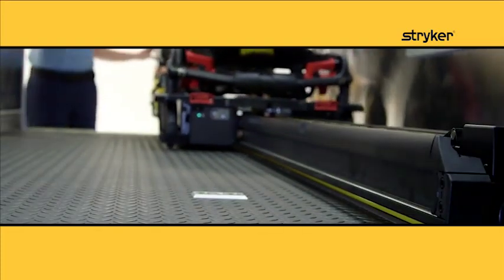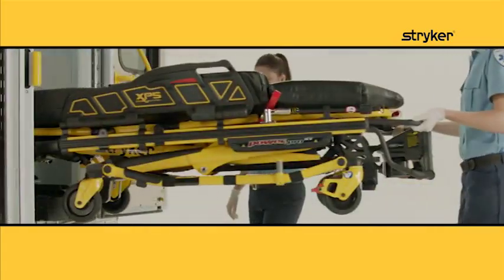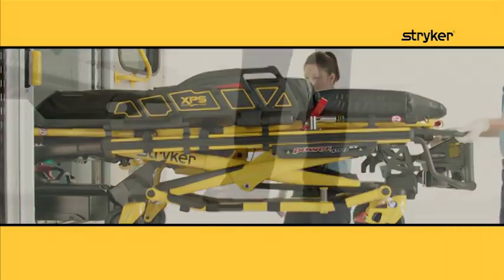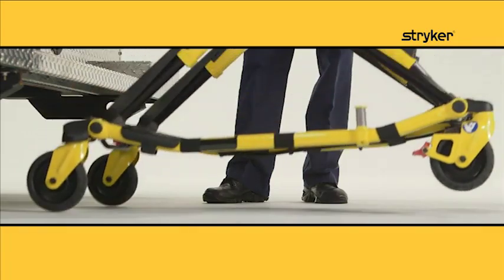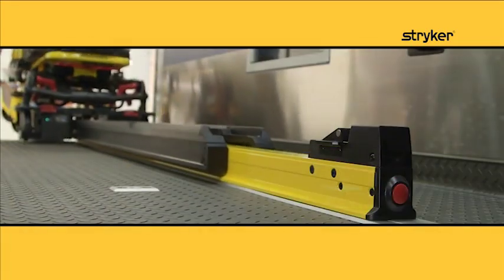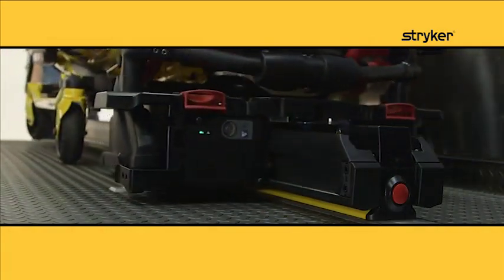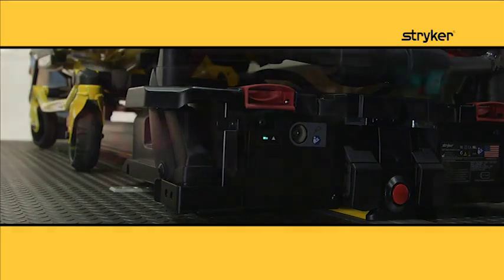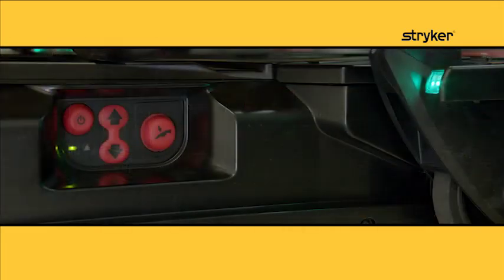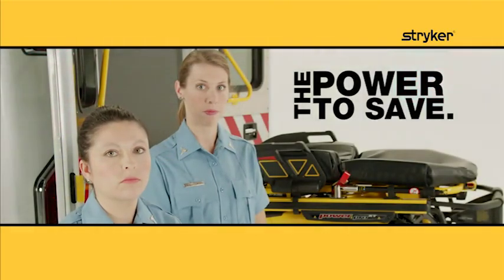It reduces the need to steer the cot into and out of the ambulance and minimizes patient drops by supporting the cot until the wheels are on the ground. This system meets dynamic crash test standards for maximized occupant safety. These design features provide you the power to save. Save yourself and save your career.